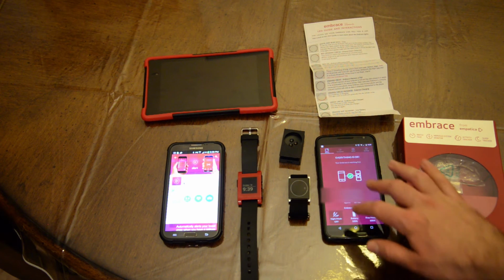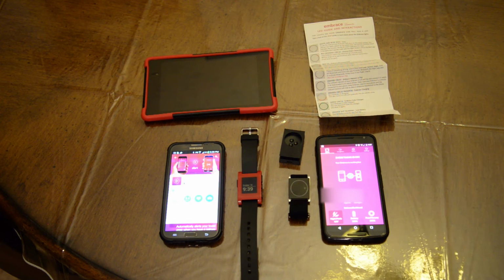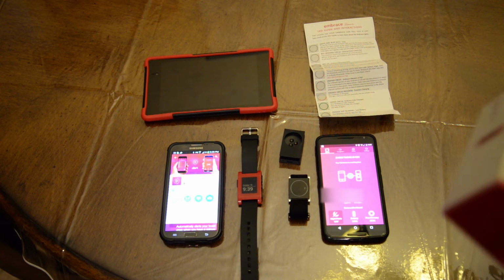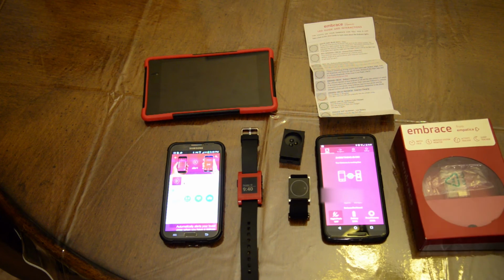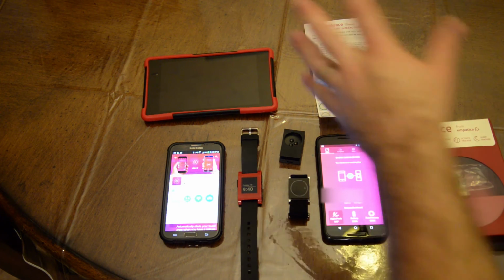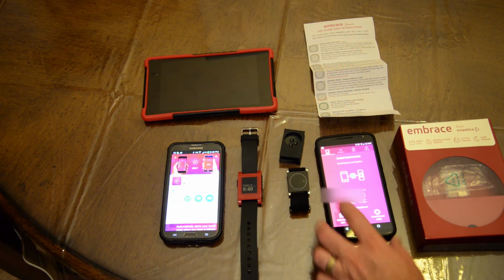Unlike the Embrace, you might actually need a new phone or a latest Android. I'm sorry, or a latest Apple. Oh, there we go. So it requires an Android 5.0, and it requires the iPhone 5 as well as an iPod Touch 6th generation or later. So tablets are not compatible with it for now. I'm not too sure if that will change in the future. But just realize that this device, you will need an iPhone 5 or later, or a phone that has Android Lollipop and above. Now, the difference between that is you need $200 for the phone. You need $200 for this watch, and you need a pretty phone itself.